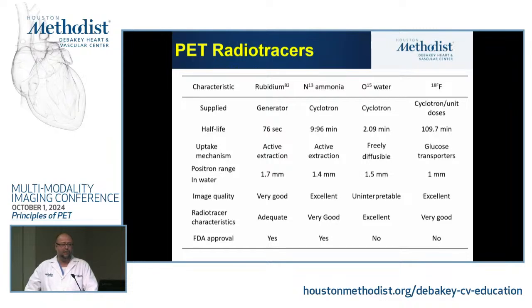And then in Europe, there are some countries where O15 water is approved. So O15 water can be used in Europe, but we do not use it clinically in the US. There is an ongoing trial with O15 water. So let's dig deeper into what's in there. This is a summary table, but there are some differences between these, and I'll show you some of the differences and how we potentially may use them clinically.